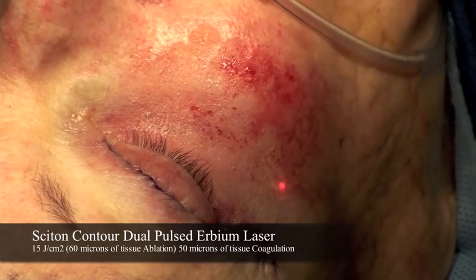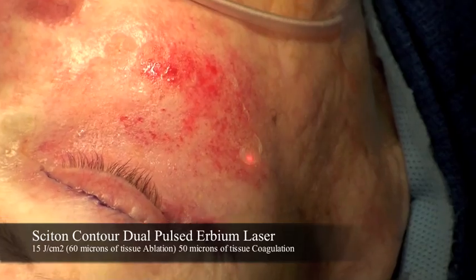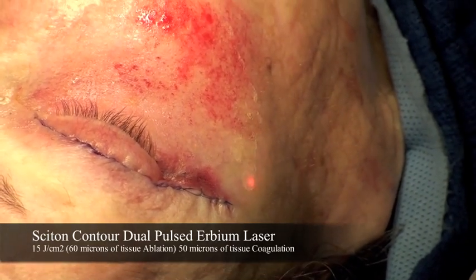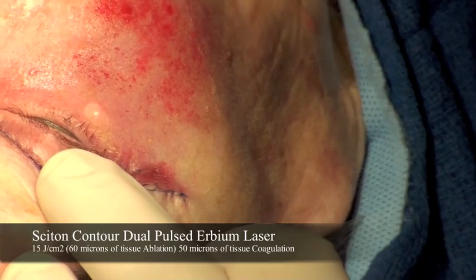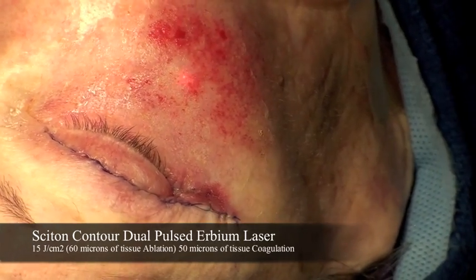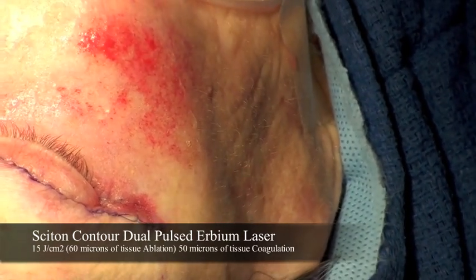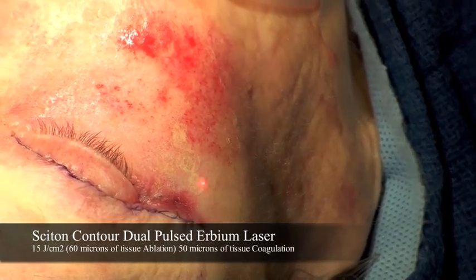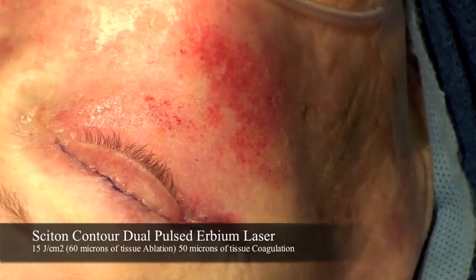We feel this new collagen and epithelium then grows on this new compact framework and replaces, we think, the shrunken collagen. There is art as well as science here, and the end point is no more collagen shrinkage. You can see this shrinkage here as I'm showing in this video, and the end point is when we see no more of this shrinkage.